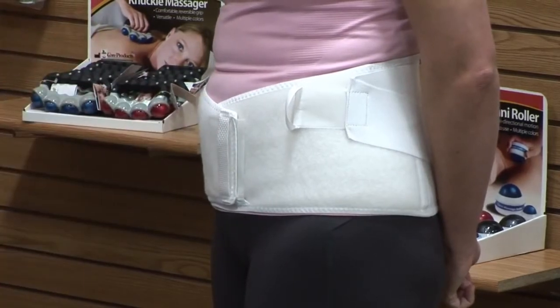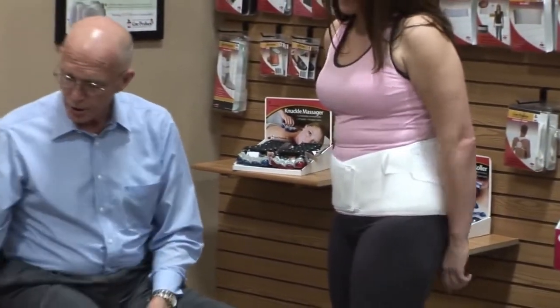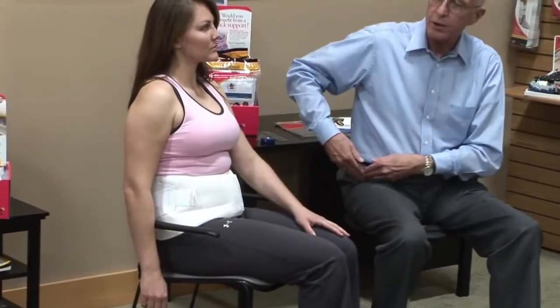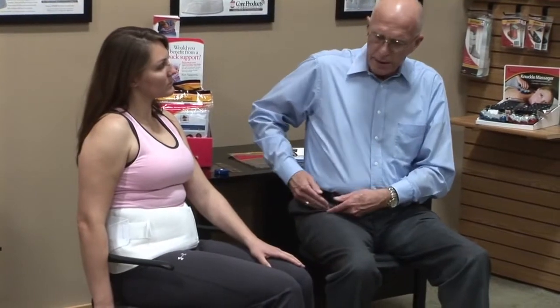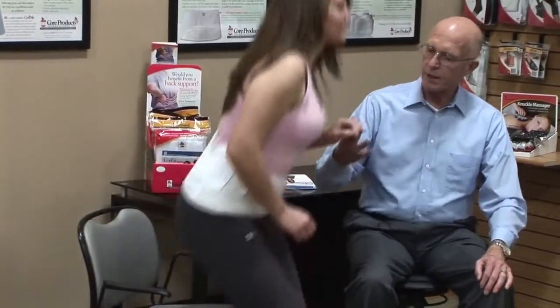That's the fitting process — we explain everything to the patient as we go. We also teach the patient how to validate the correct position: ask them to sit down. When seated, the bottom of the device should come right to the crease at the groin. If it's too low it may dig into the groin and be uncomfortable; if it's too high there'll be a gap and we're not supporting the lower abdominal wall. It should be right at the groin, and we teach the patient to always sit down and check that it's at the right height.